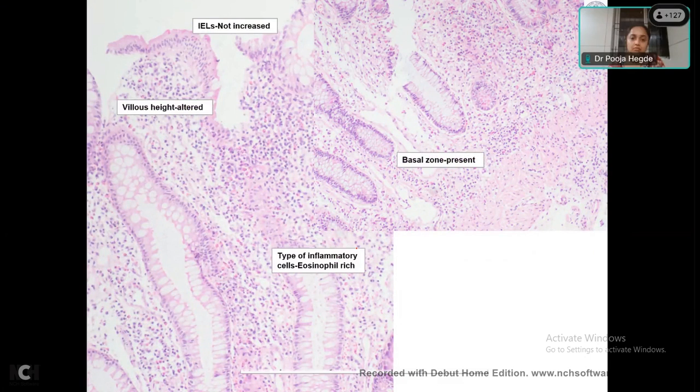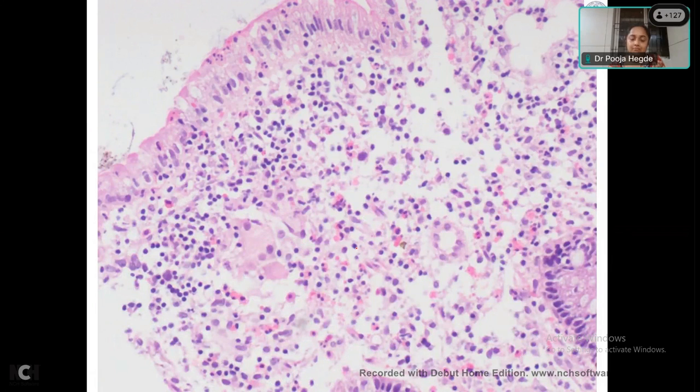Yes, sir. So this is the mucin granuloma. See, these are nice histiocytes with round nuclei, but they are conglomerated histiocytes forming those mucin granulomas. If you do AB PAS, you can see some mucin within the cytoplasm also. And here, in addition, what we can see, there is some form of activity. Can you see that?